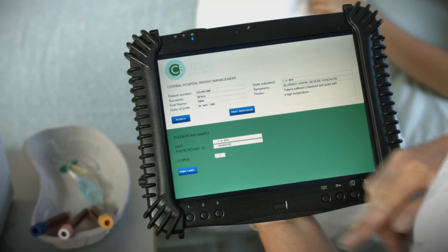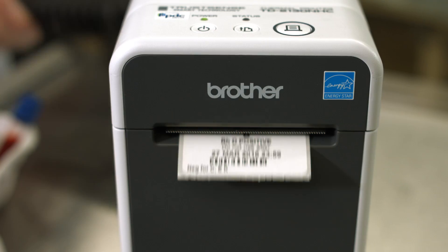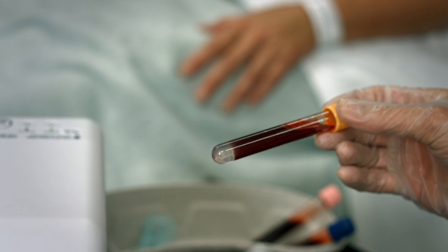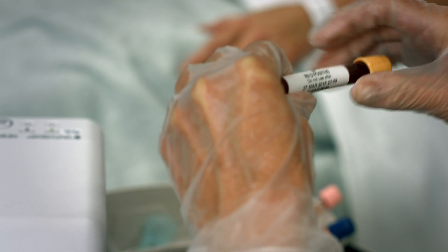TrustSense technology lets you print both labels and wristbands from the same machine — simply drop in the required media. The Brother TD2130NHC is the perfect patient identification solution.